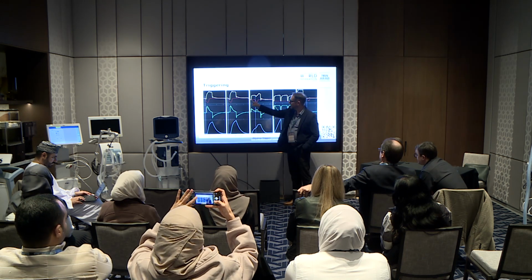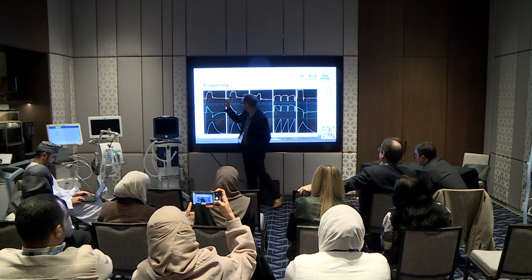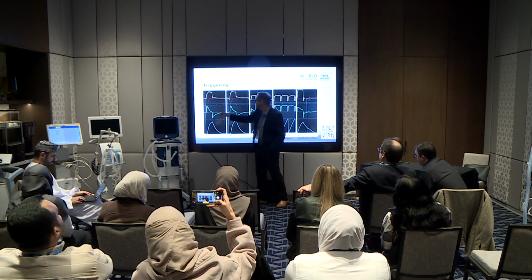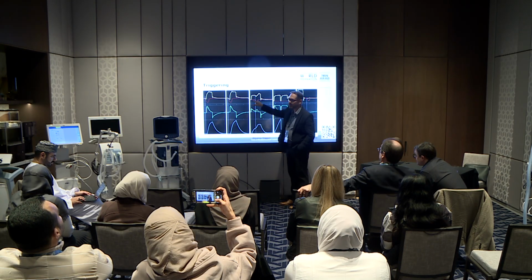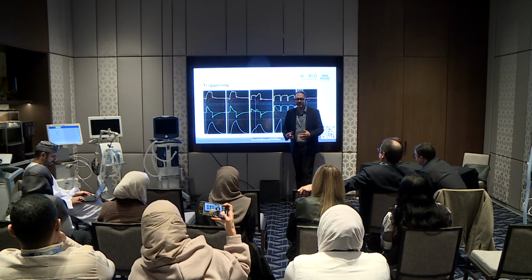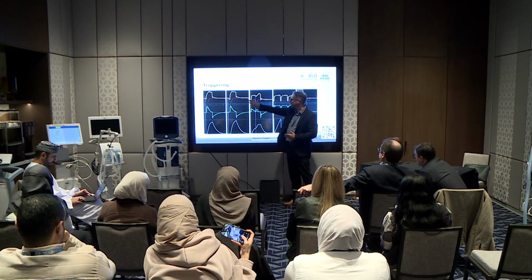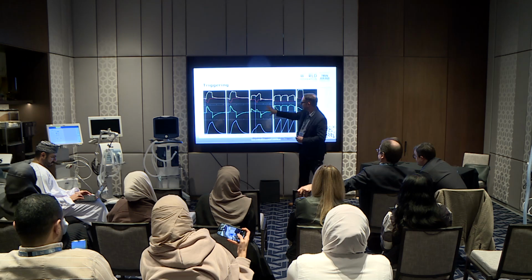But notice the patient did not trigger. See how this ventilator turns yellow, or white. I don't know why it didn't turn white there. But this is flow trigger, it turned white here. This is pressure trigger, it turned white here. This one, the patient did not trigger. But look what happens during inspiration. There's this effort. It's almost like a response, like a stimulus. The ventilator comes first, then the patient, and this is why it's called reverse triggering. Okay? But there's not a breath stacking breath, right?